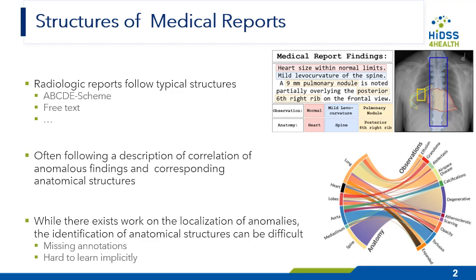Chest X-rays are one of the most common imaging methods in radiology. They are often performed as a follow-up to surgical procedures or to initially investigate patients with chest pain. During the checkup, a radiologist will note any normal and abnormal state visible in the image.